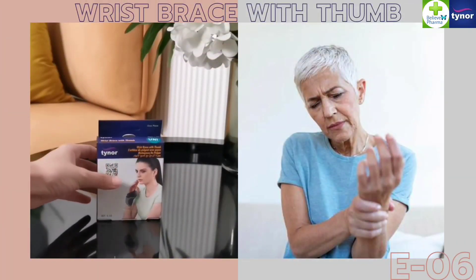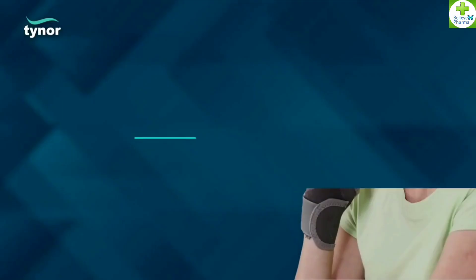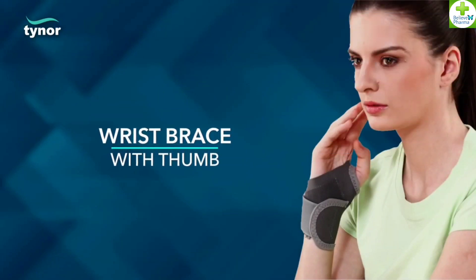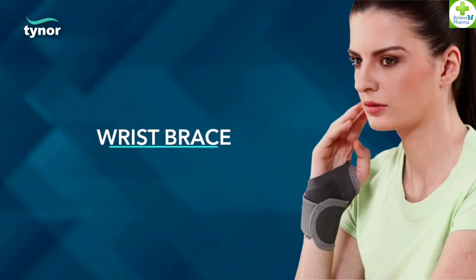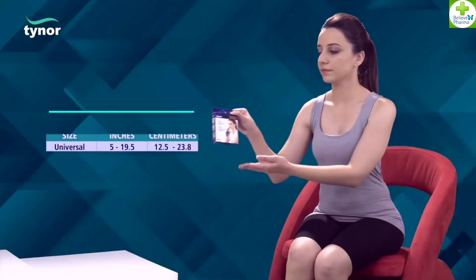Here, we will discuss how to wear the wrist brace with thumb. The product comes in universal size. Measure circumference evenly around the wrist joint.